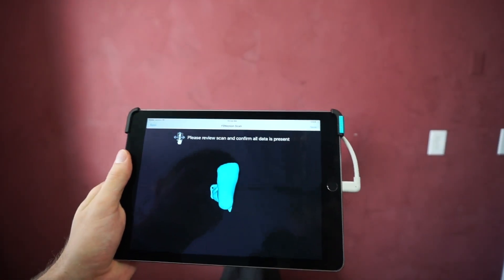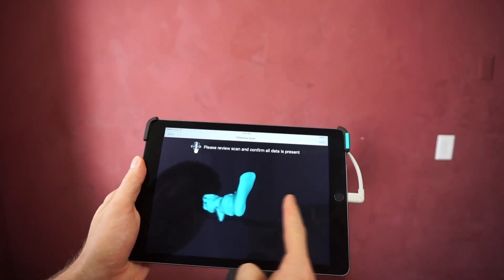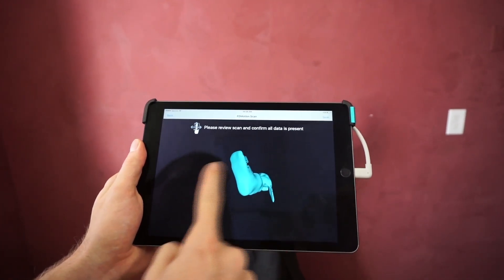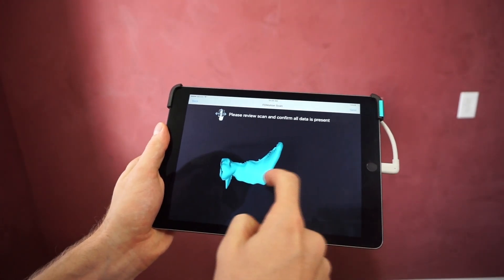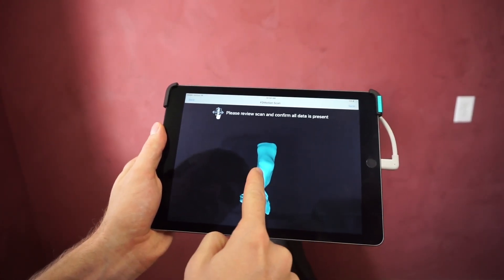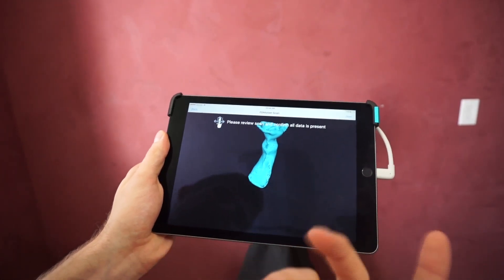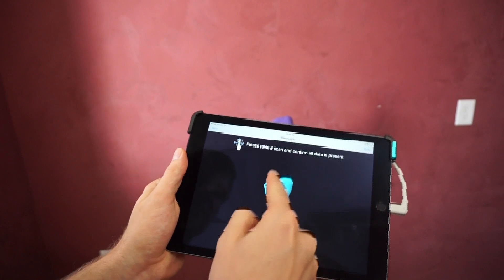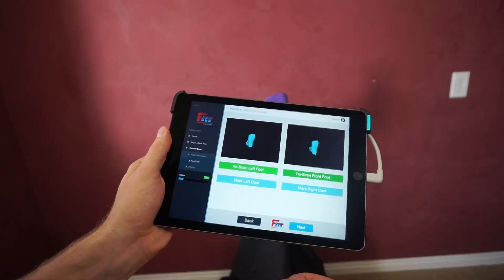Now this step is very important: we're going to review the scan. Using your finger, you can pan left and right. Make sure all the arch data is there, all the lateral data, and make sure we have good information on the heel. You do not need to worry about the top of the foot — we don't need that information to build an orthotic. If all that looks good, press the save button and scan the next foot.